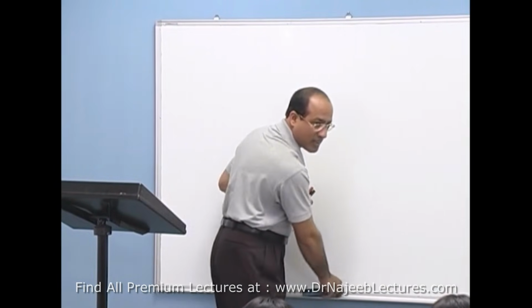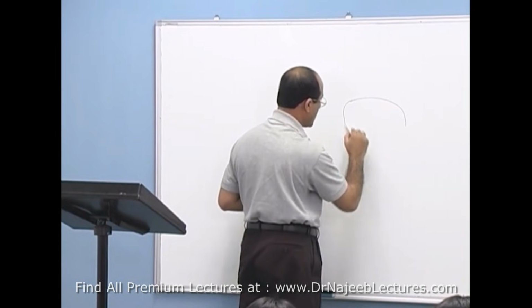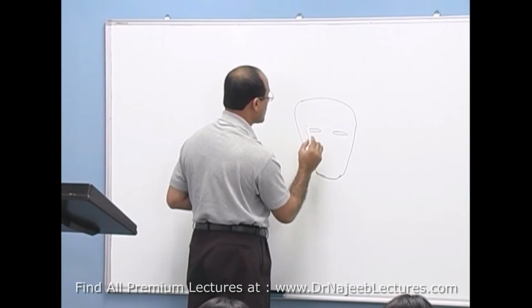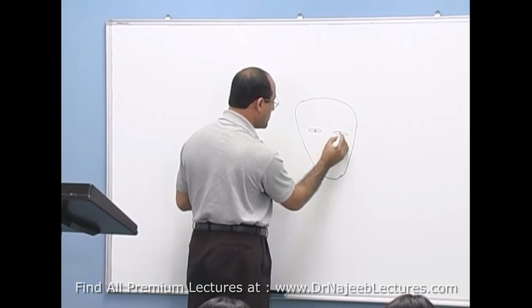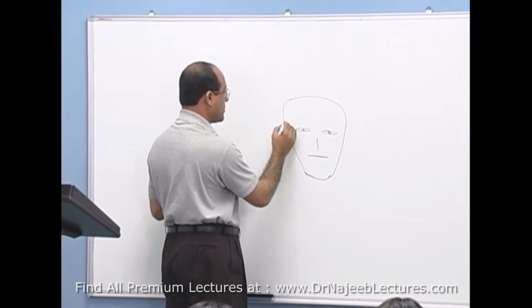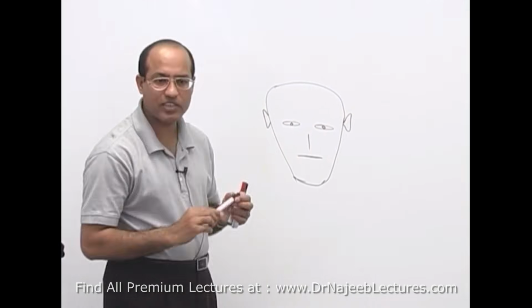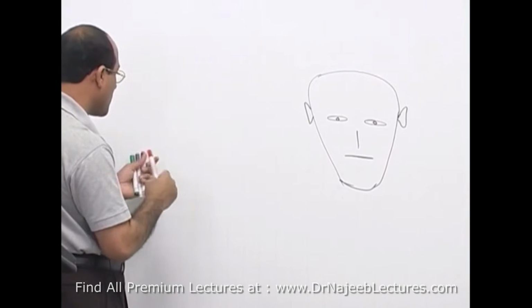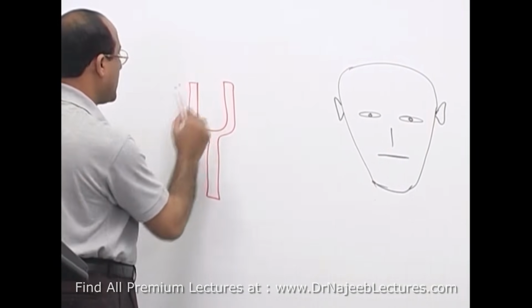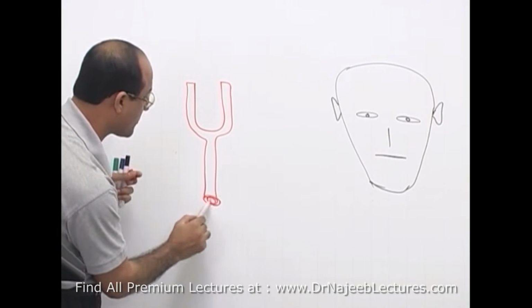Now, we are going to talk about, first of all, Weber's test. In Weber's test, what do you really do? Of course, first of all, you must have a tuning fork, and you should get it vibrating. Then where do you put the base of the tuning fork?